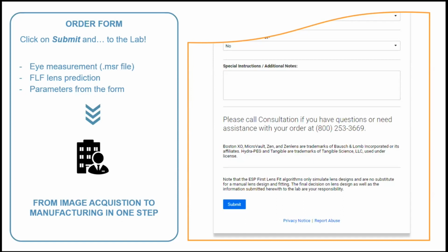So we really, really hope, and as Rainier and Arnold said before, we're really very happy to get feedback. So let us know in the next couple of weeks and months how it works. But we've created these order forms together with the labs. And we believe this will really make it easier and will avoid this back and forth that sometimes was needed for things missing or things forgotten. So hopefully this helps you a little bit in your practice.